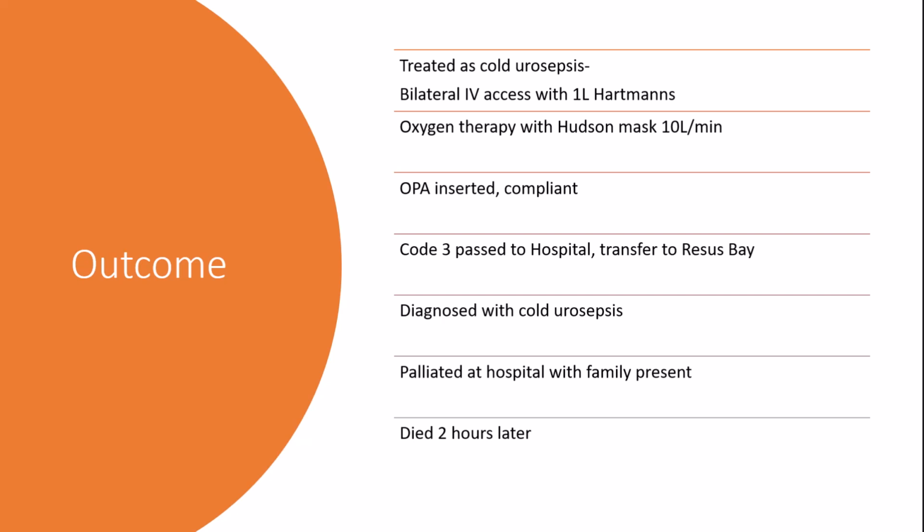Oxygen therapy to maintain oxygen saturations due to being unable to get a good SpO2 reading. But the patient didn't have a history of COPD, so we were quite comfortable with giving some high flow oxygen therapy until we can get an accurate reading of the SpO2.